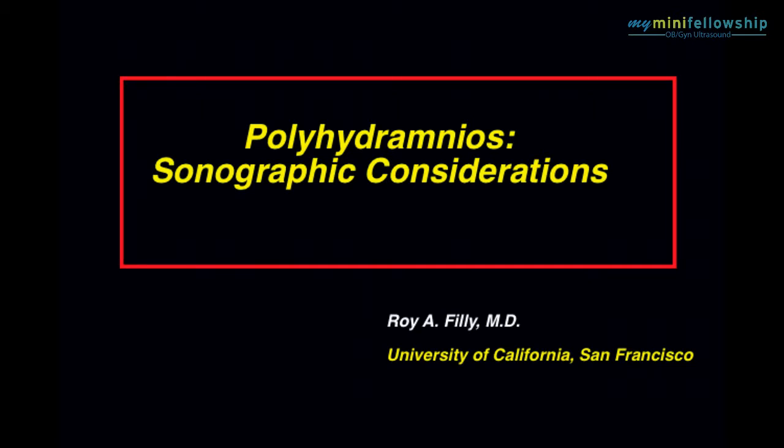Today we're going to discuss polyhydramnios. This is a subject that I consider one of the most diverse and confusing of the entities that we must deal with in obstetrical sonography. As you know, variations in the quantity of amniotic fluid are not terribly uncommon, and this is certainly an entity that you will have to deal with several times during the course of a year.